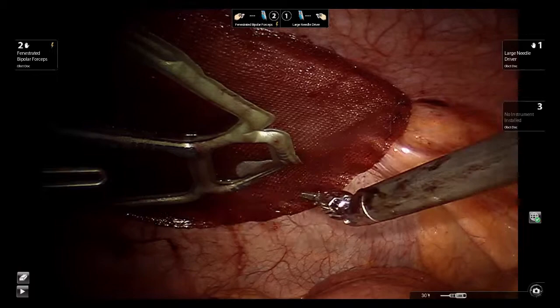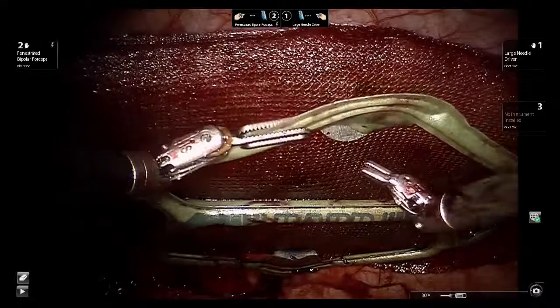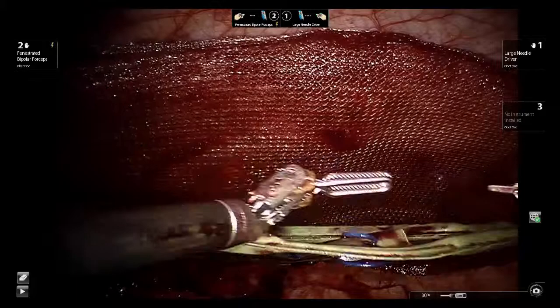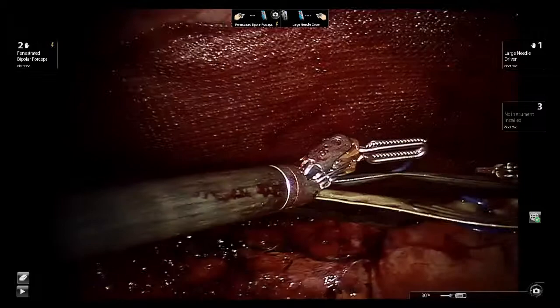At this point, one simply begins to pull away this green component and its attached suture material. And ultimately, this will be removed from one of the 12mm trocar sites. We also proceeded to close the 12mm fascial defects utilized for the camera site and the system port with a fascial closure device.